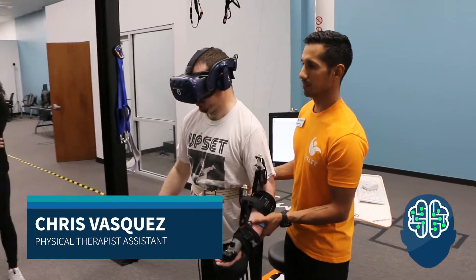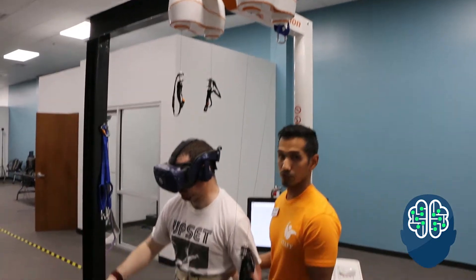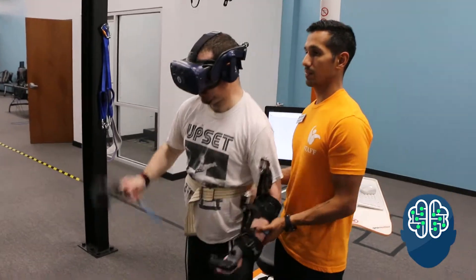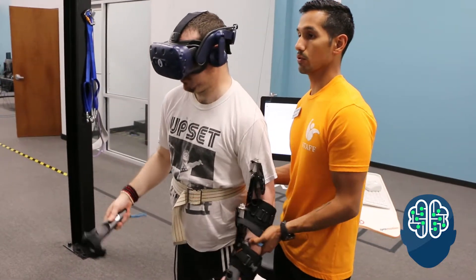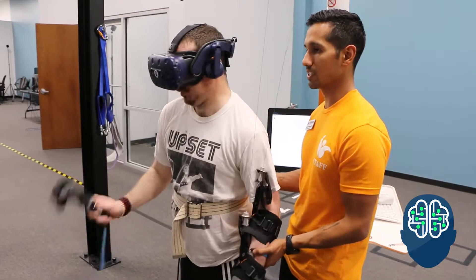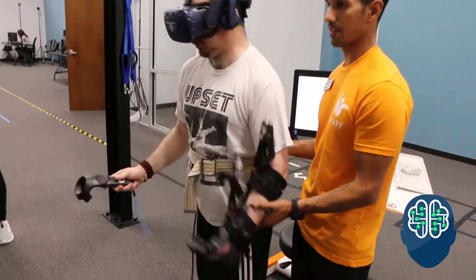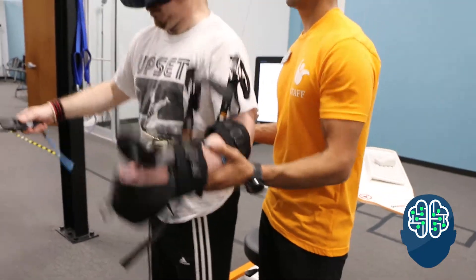We're using an arm weight support system with a robotic device while playing virtual reality. Matt was left side affected, so we're working on getting more engagement through that left arm with VR as well as arm weight support. It's off-weighting his arm to help him lift it a little more and get more activation, get more range, strengthen in that area, and just having fun doing it.